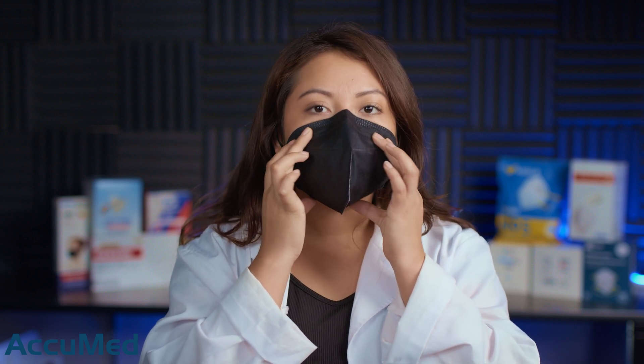They are very large. This is a 6-layer mask and I feel like it does have quite a bit of collapse. With that being said, let's go ahead and run the tests on our TSI machine. We're going to be testing both filtration efficiency and pressure drop.